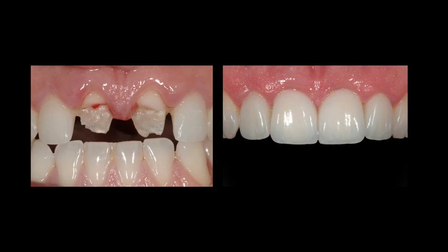So here we are before and after, and I think it's a pretty reasonable result for this patient, and part of it is good implant positioning, part of it is the ability to put the provisional crowns on right away and support that excess tissue that he had, and part of the result is because we were able to take an excellent impression that represented what we achieved with the provisional restorations. And here's the patient. You can see he has a high enough lip line that he shows most of the outline form of his gingiva around these implant crowns.